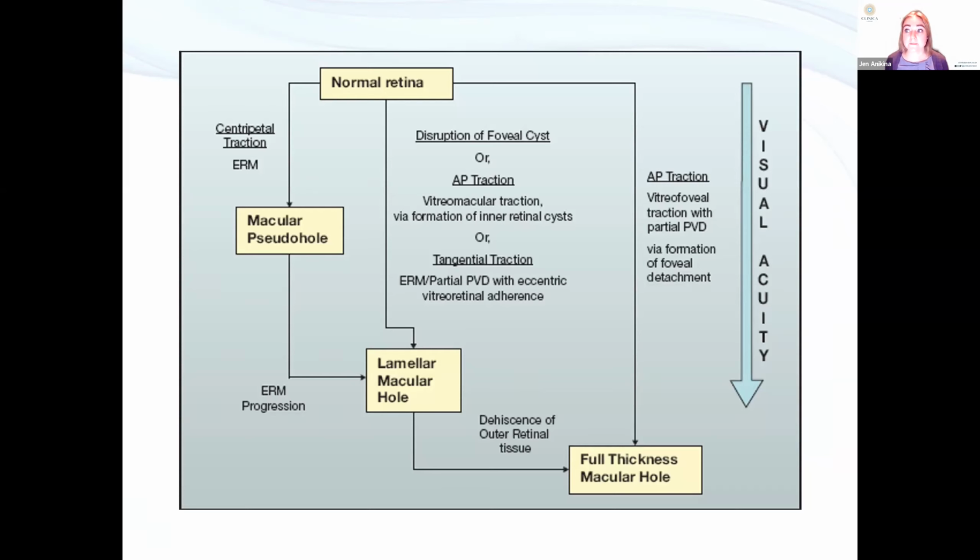So it's vision drop and patient symptoms, and it doesn't matter what the picture looks like. You're not treating the picture, you're treating the patient. So it doesn't matter what the picture looks like, refer according to symptoms.